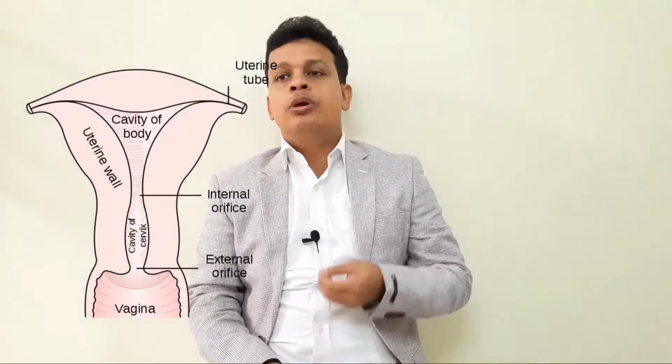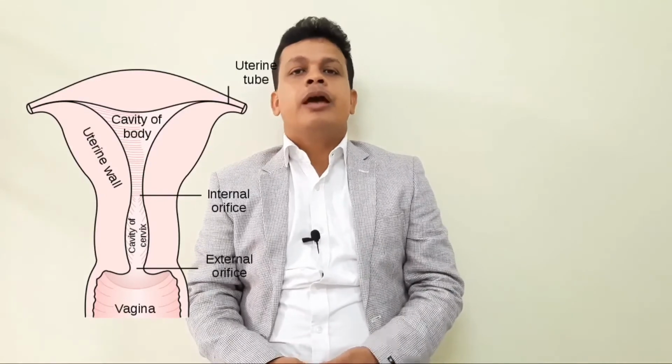So for example, if you consider vaginoscopy, the first part of hysteroscopy, you can have a very good view of the vagina, the upper part of the vagina, the fornix as well as the external os. Many masses and lesions can be evaluated, and sometimes management also can be done. Now going to the cervix, the whole of the cervical canal can be seen. Any pathology, any lesion can be made out.